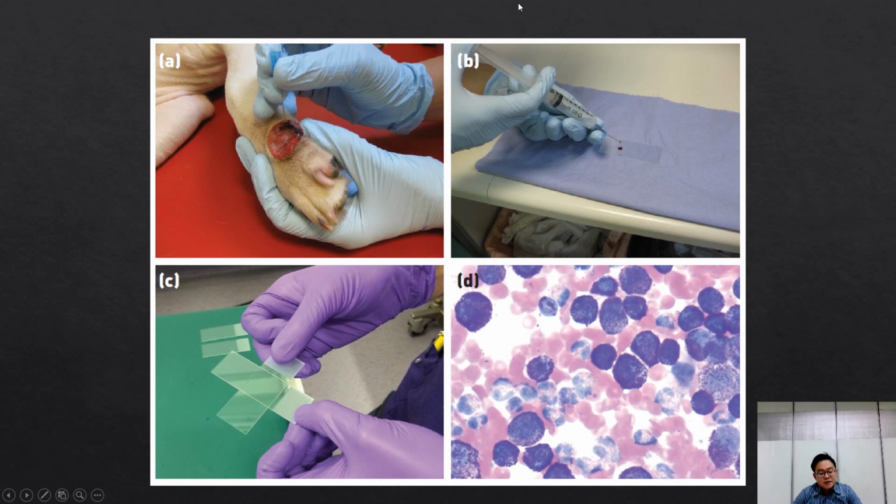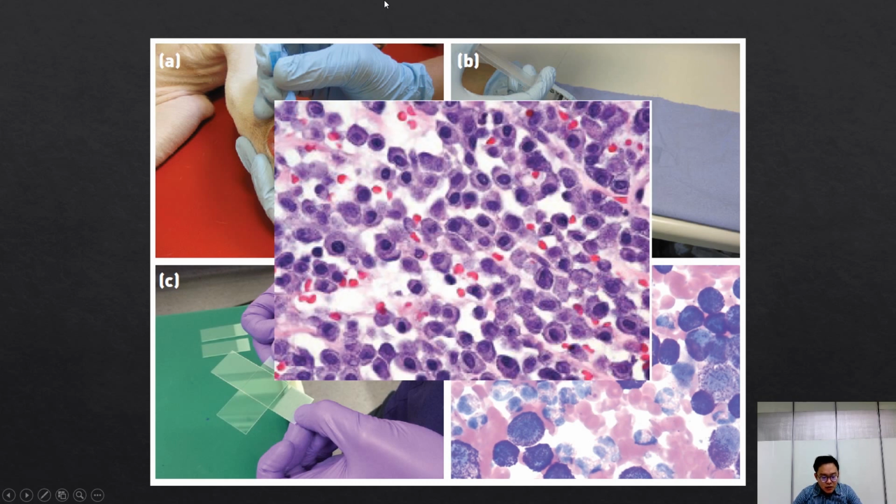This is an example of mast cell tumor cytology. All these big cells are a homogeneous population with specific blue granules in the cytoplasm. So clinical pathologists would interpret that as mast cell tumor.